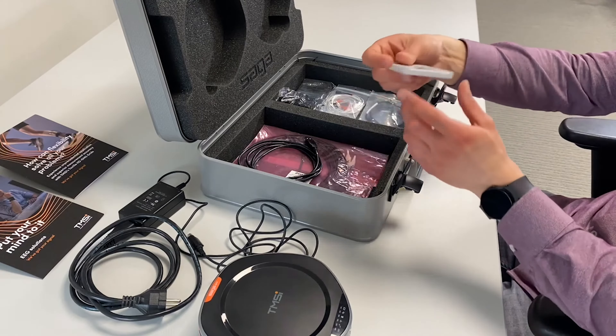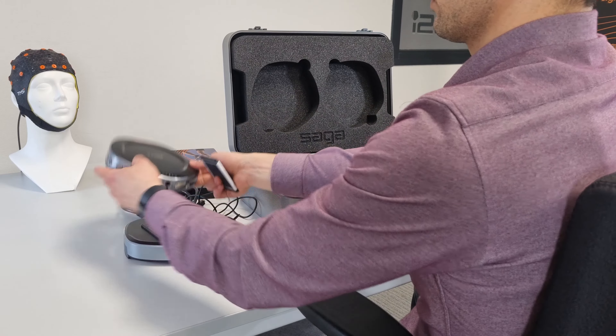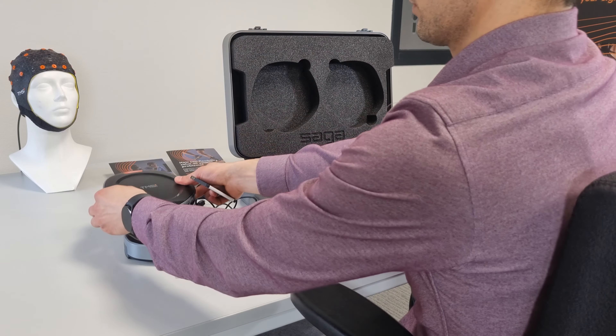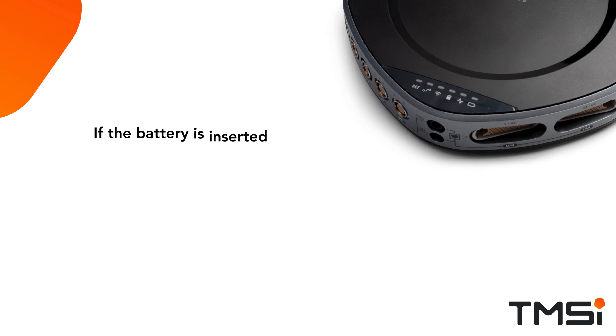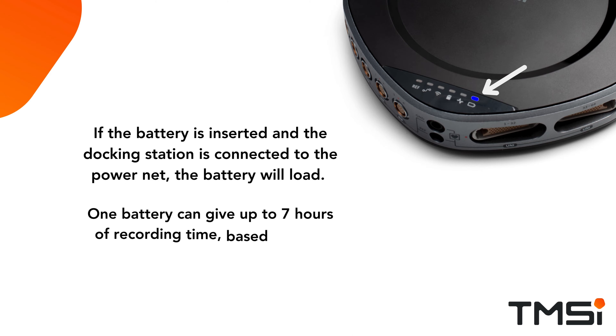One battery is provided by default with the purchase of Saga. The battery can be inserted in one of the two battery slots on the data recorder and can be used for mobile measurements. In a later video, we will explain all measurement options for Saga. If the battery is inserted and the docking station is connected to the power mains, the battery will charge. One battery can give up to seven hours of recording time based on your recording setup.